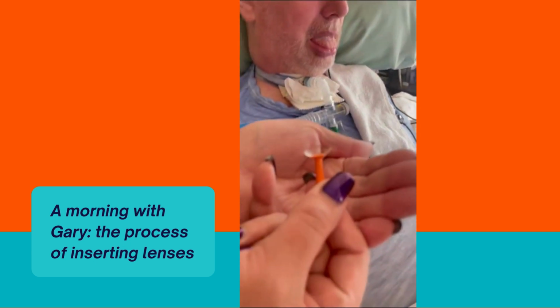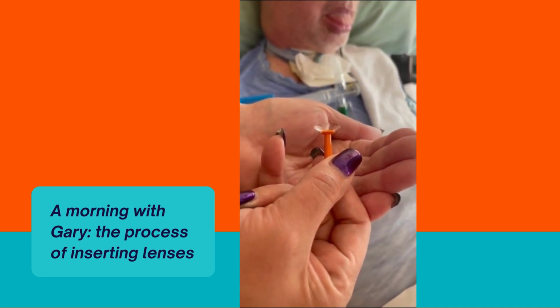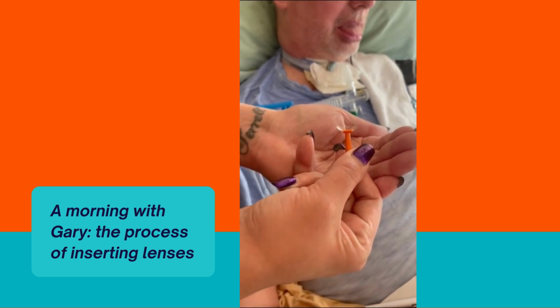And you're going to want to cup this way just in case your contact falls. It falls in the palm of your hand. Right. So she's just pulled it back out. Now, she didn't have to because Gary's was in right. She's just showing you guys how it is. So she'll put another one back in. So let's do it again.